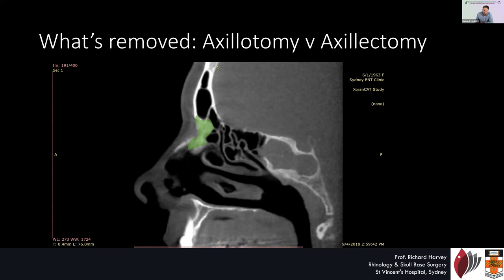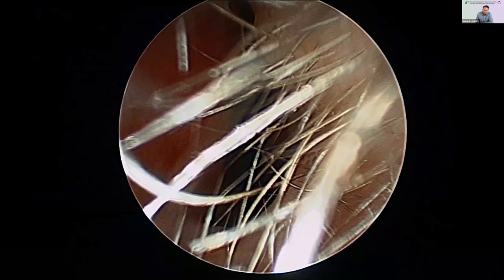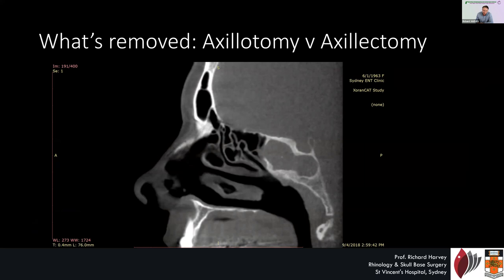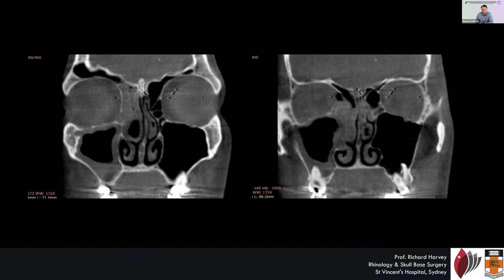It's not simply just removing the front wall of the agger nasi. We actually take the entire bone here. So there's the bone — we take that entire thing. And when we do that, we get zero-degree access directly into the frontal sinus. It is not something that you can do with just a Kerrison — you have to use a drill for this technique.